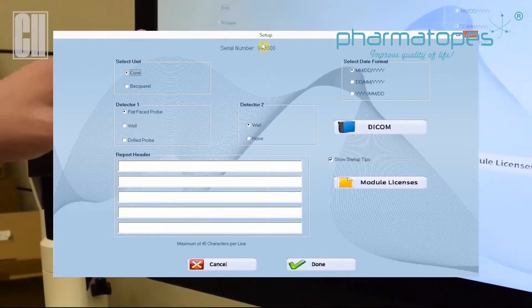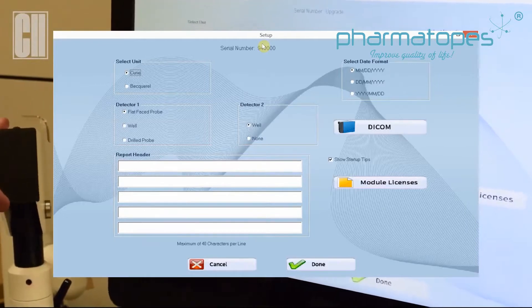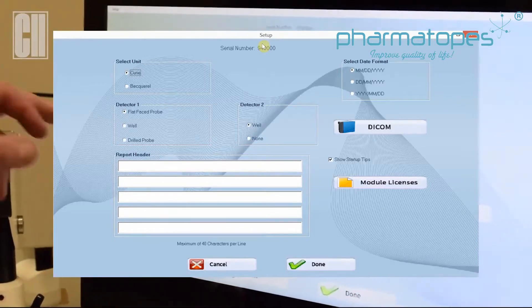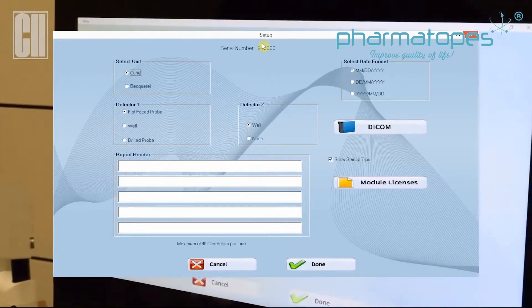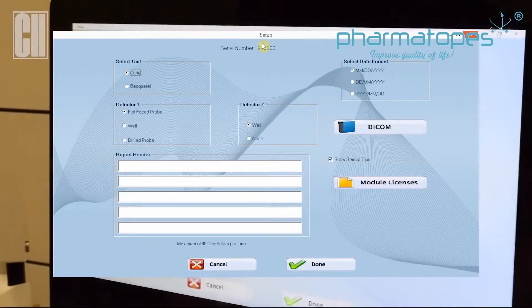Detector one and two should already be set accordingly to the order. The report header should match typically the facility's address.